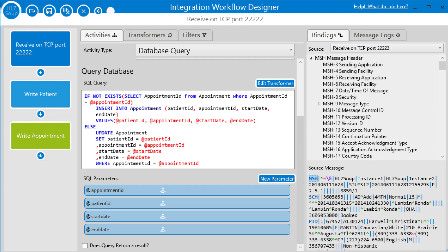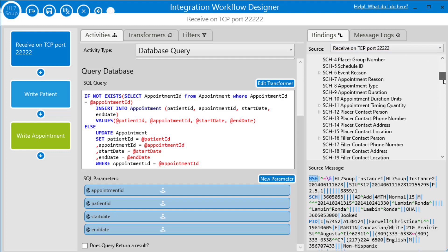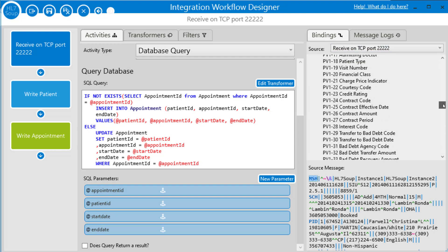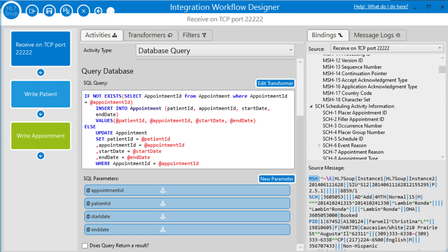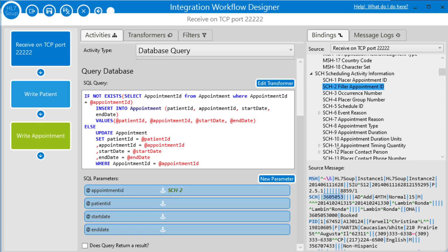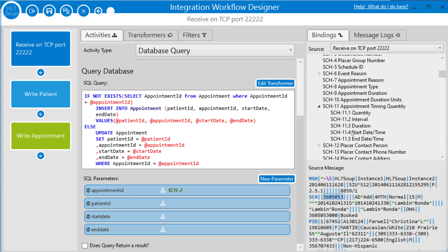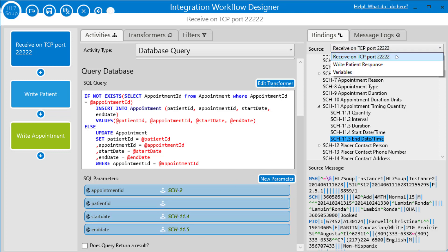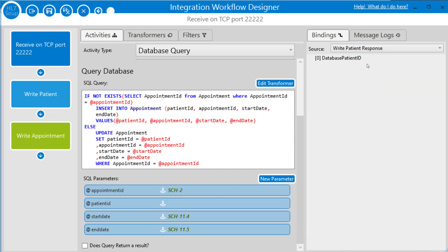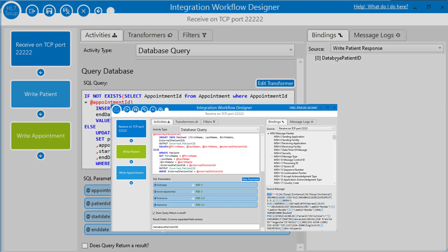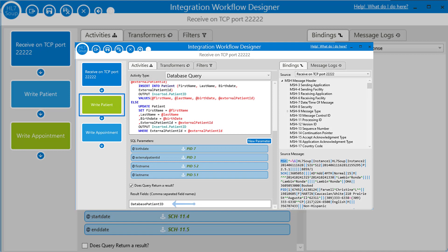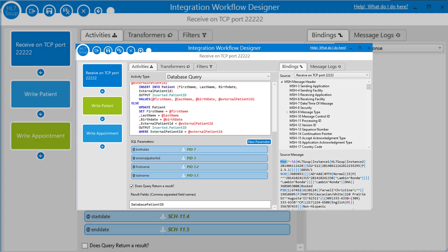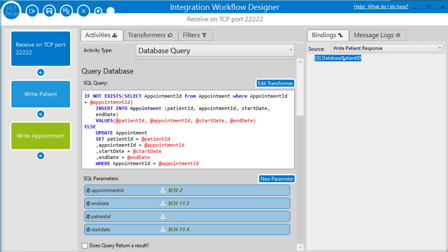So out of the incoming message, we need to get the appointment ID from the SCH2, the start date. And in this case, we're using the SCH 11.4 and as the end date, the SCH 11.5. And now we just need the patient ID. We can't get that from the incoming message. We have to change it to the response of our write patient activity. And there's the ID that we created that corresponds back to this. And we can just drag that in as our patient ID.